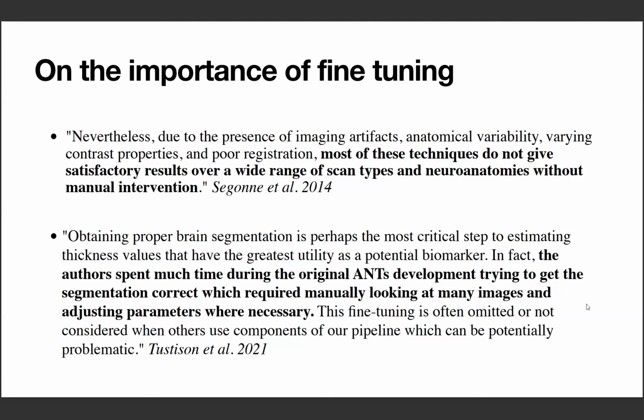So all the tools that looked automatic today, the solved problem of FreeSurfer at 3 Tesla, the authors put a lot of time into actually making that work before it became automatic for us. And maybe we're at the stage that we're doing this now so that by the next workshop, things will be automatic for people doing laminar fMRI.